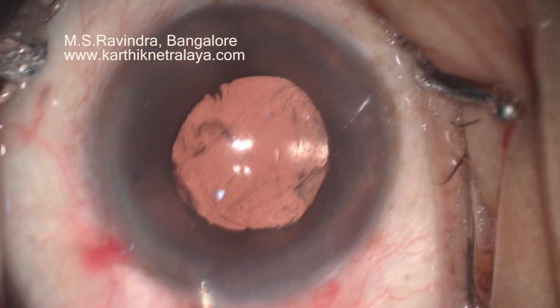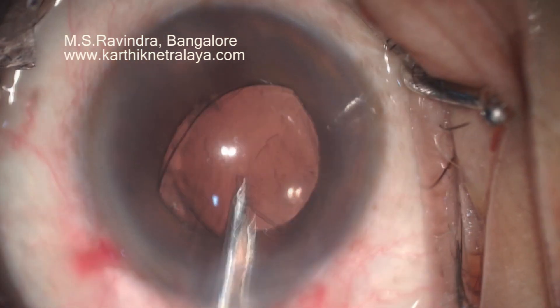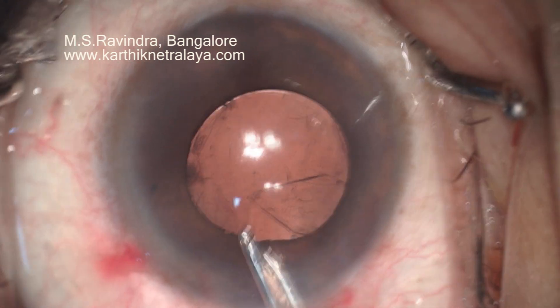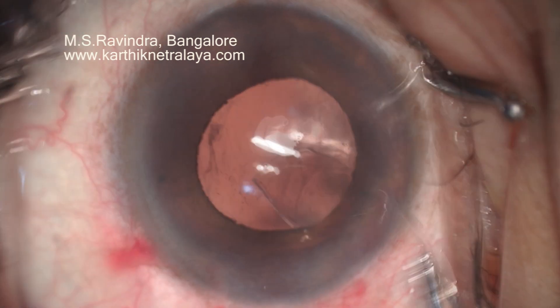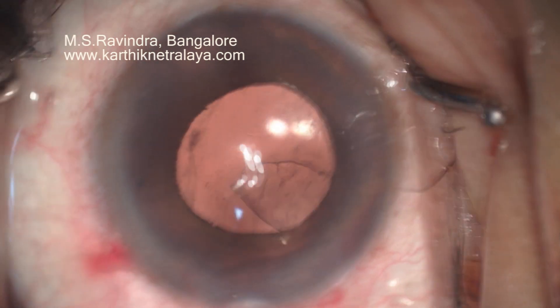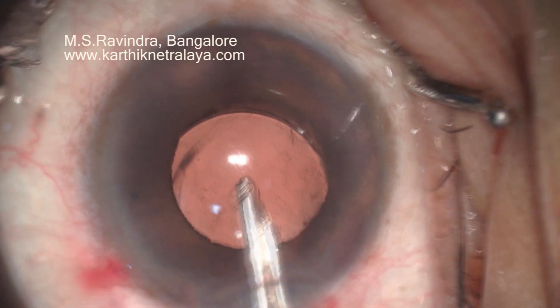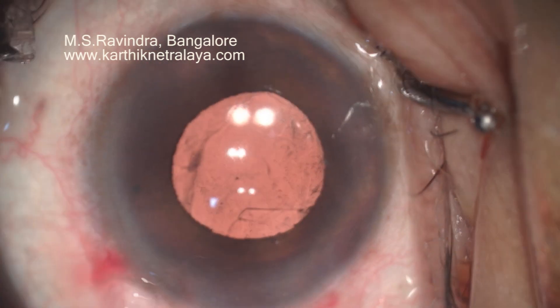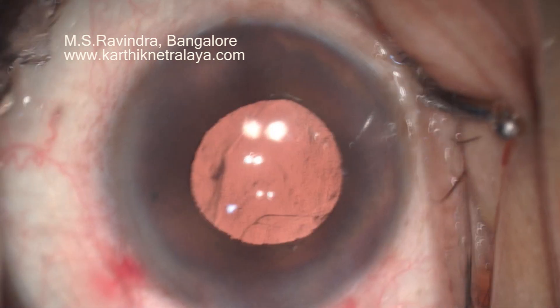There is some prolapse of the capsular bag at 6 o'clock position as you see on the screen, not 6 o'clock of the eye. There is a capsular flap — I do not want to remove it, I just want to push it with the Sinskey cannula under the iris. This is the anterior capsular flap. If necessary, I can YAG it post-operatively, but the patient has done extremely well post-operatively. My personal experience says that hydrophobic acrylic lenses can be implanted in the sulcus in special situations.